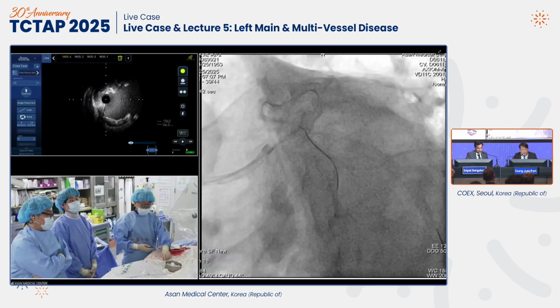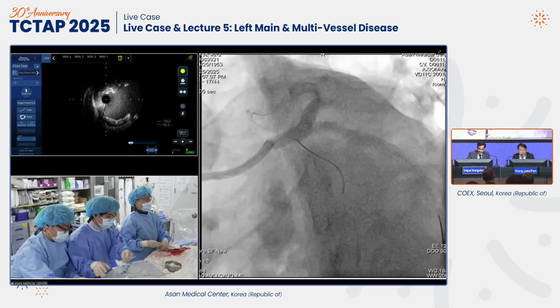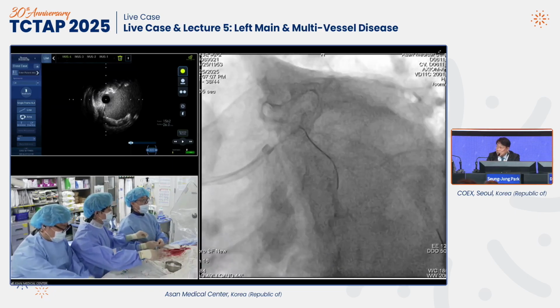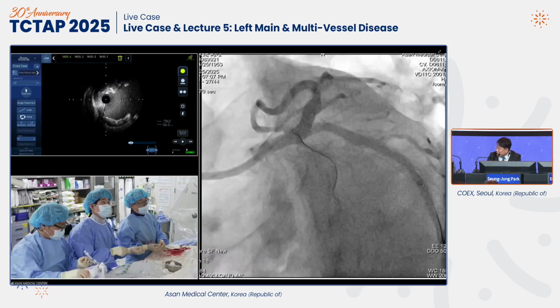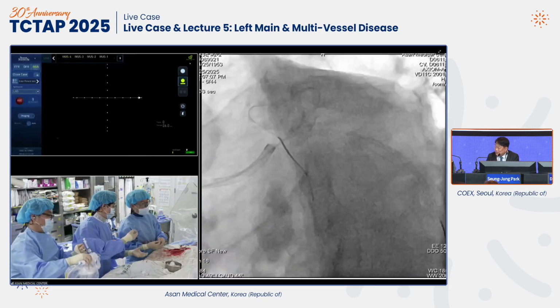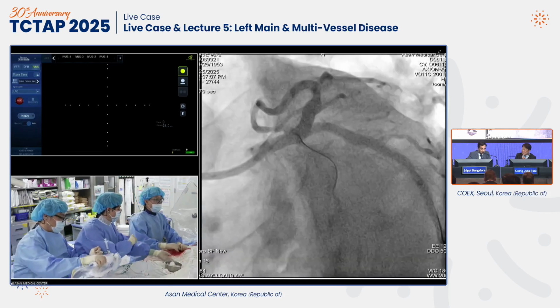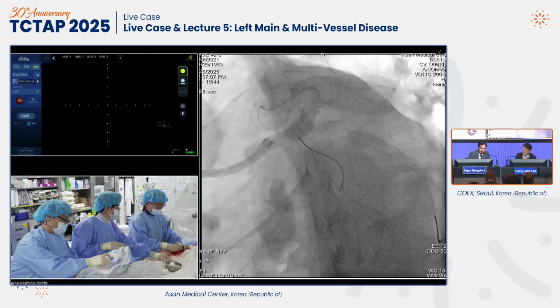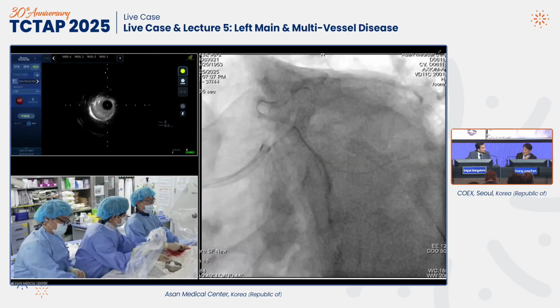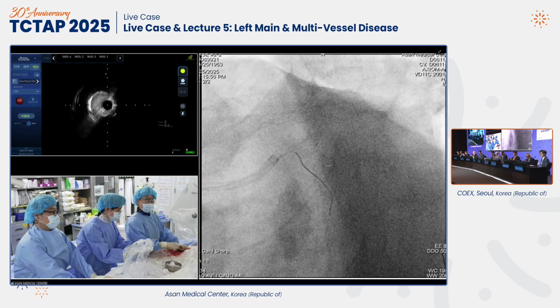Any comment or any suggestions? Really perfect cases, right? I think it's a very difficult one, and still, I believe the bigger the better, and the angiographic figure is good, right? Yeah, no, I think a beautiful result and a good demonstration of two complex cases. Just as we move on to the next one, first of all, congratulations, beautiful cases. Thank you so much.